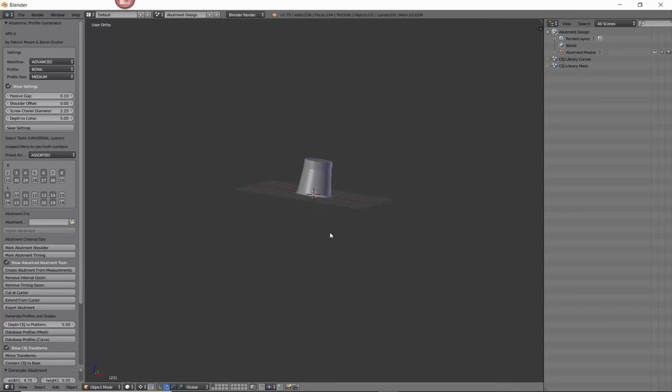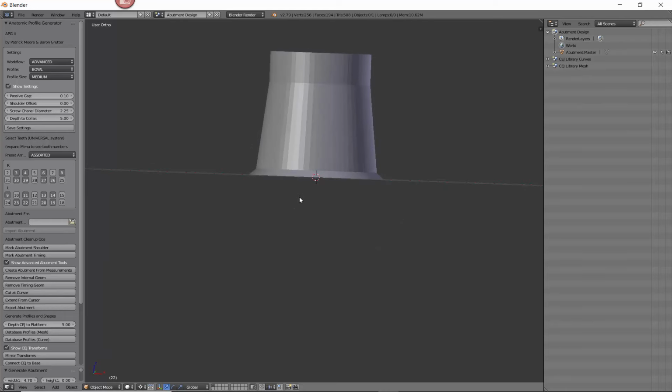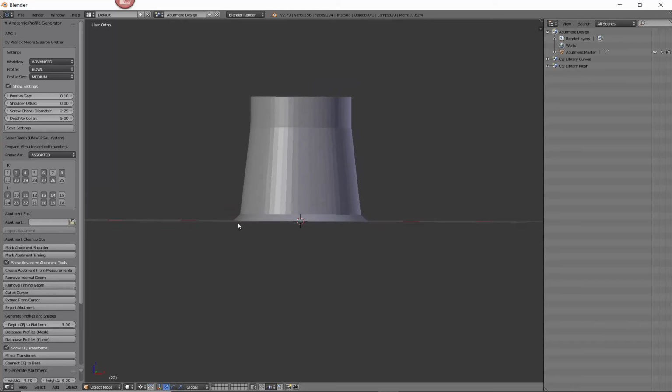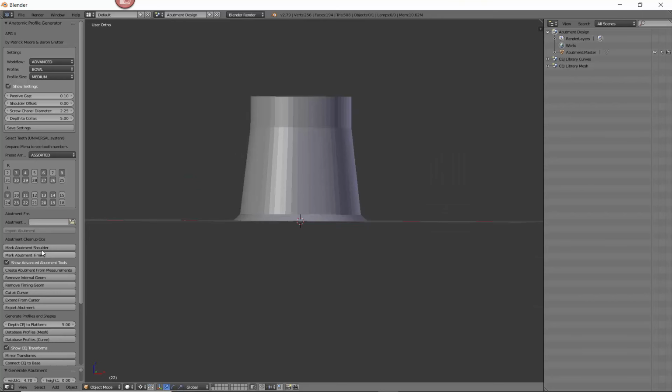Now you might be thinking, well, that doesn't look like it. It's just this short little squat thing. Well, that's all that's important for this. I don't need the entire abutment. The connection doesn't matter. This is what the healer is going to fit over top of. And if I try to get that kind of close to level, and now I bring up my abutment, you'll see that the shape is the same. This portion right here is all the same as this. So now I'm done. I have created my abutment.